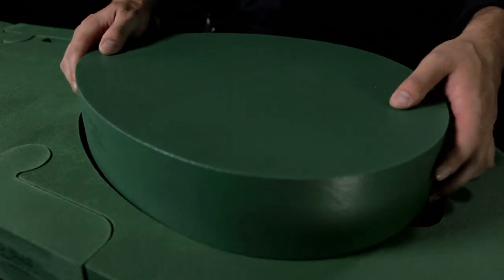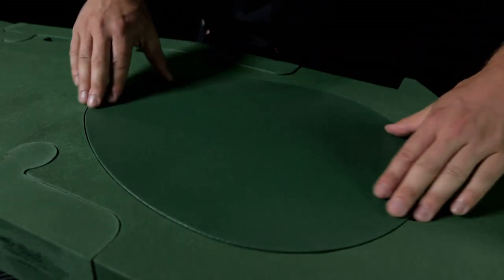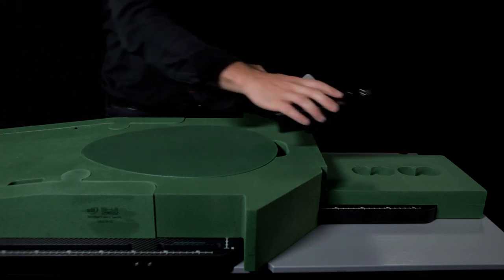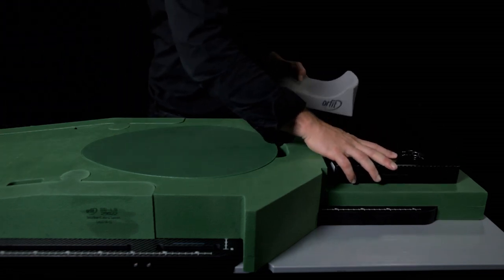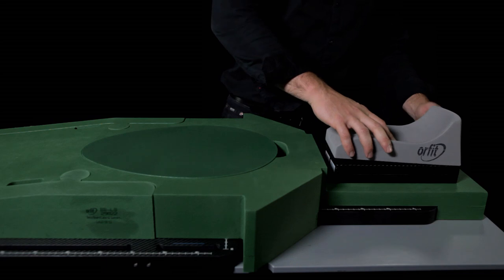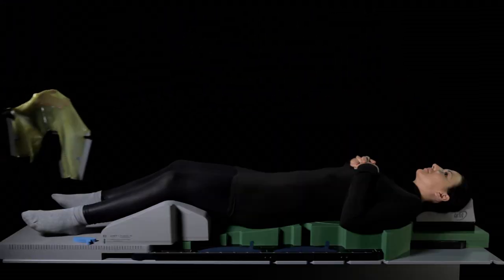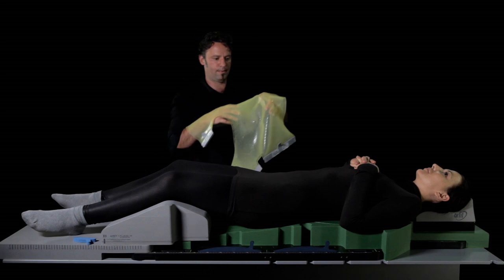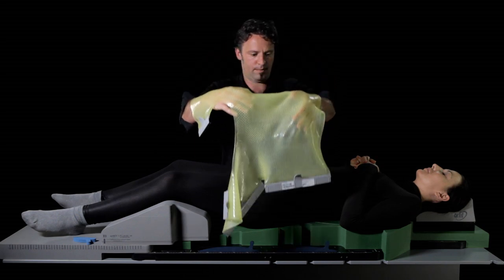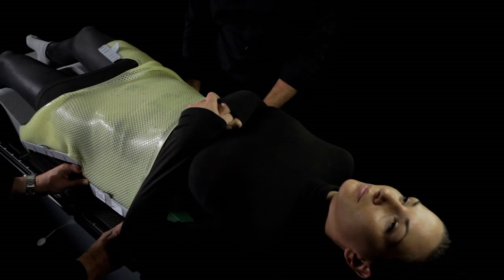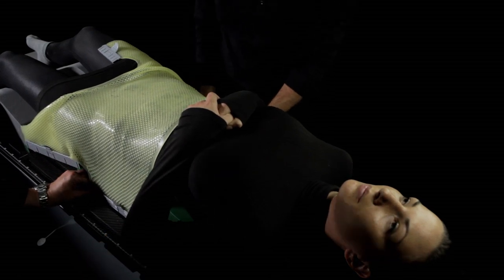The belly board can also be used to treat patients in supine position. In this case, use the full insert. The head is supported using a normal head support without a lateral neck support, placed on a 40mm thick block. When the patient has been placed in position and the leg separator has been applied, a pelvic cast mask can be placed here to increase the precision of the patient's treatment.